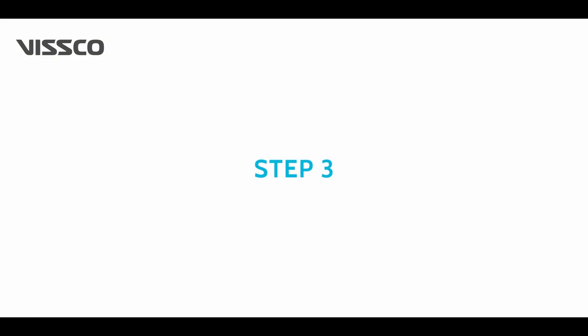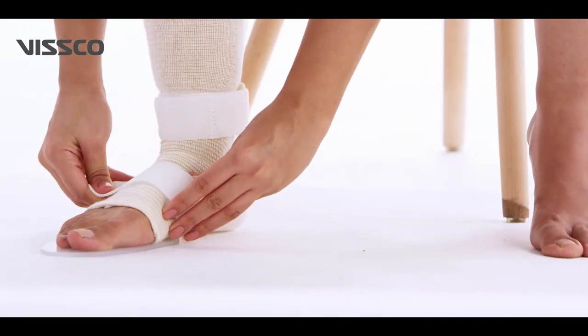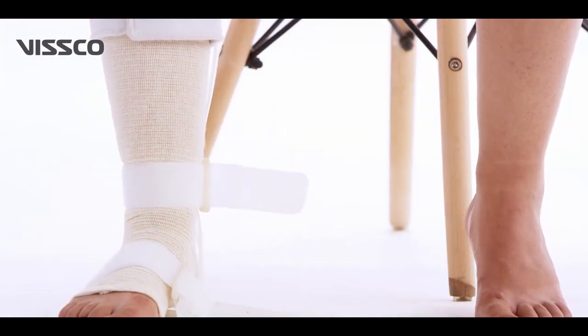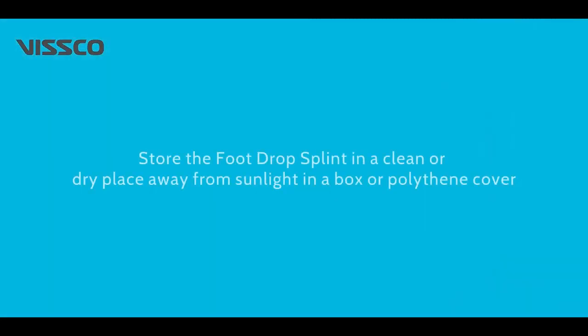Buckle the calf strap, followed by the toe and ankle straps. To remove the product, remove the toe strap followed by the ankle strap, then unbuckle the calf strap and remove the foot drop splint.